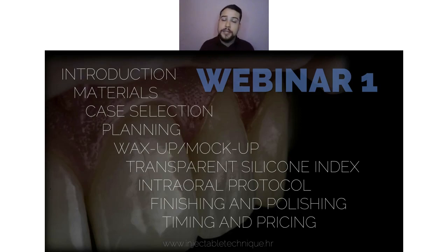Later on, how to check it in the mockup, which things to check, and what to improve if you see something in your mockup phase. The full production of the transparent silicone index and some modifications that I bring to the technique.